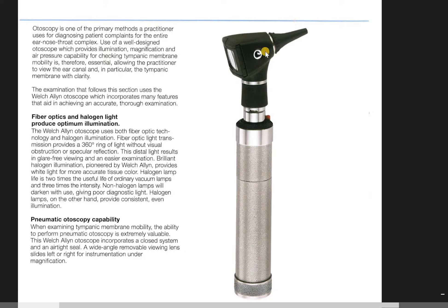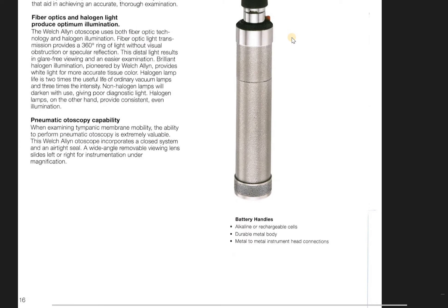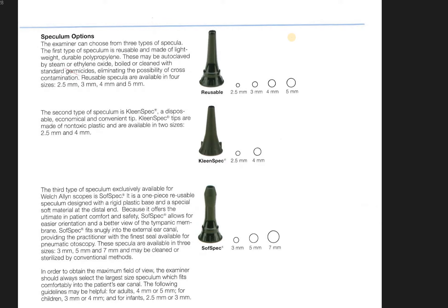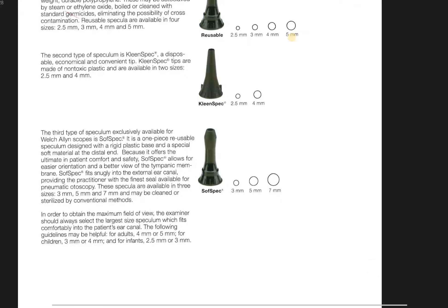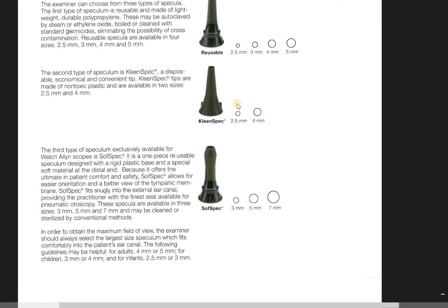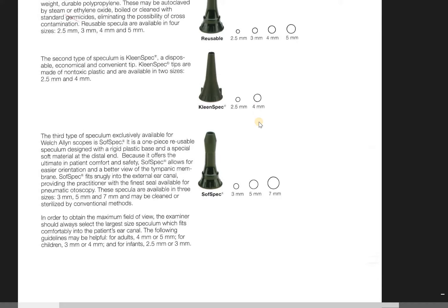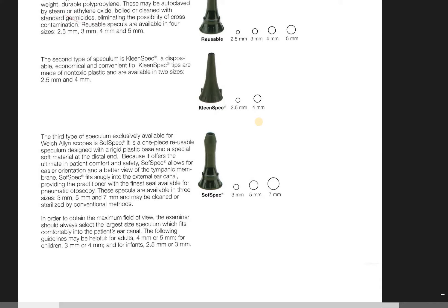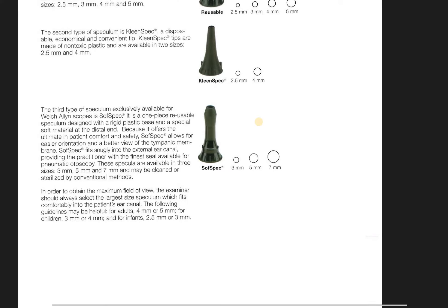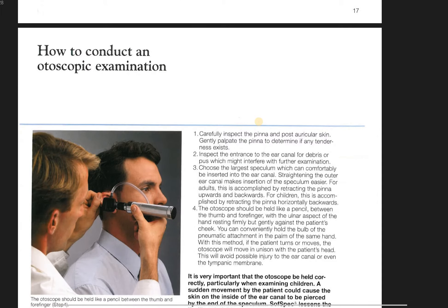You're going to have the otoscope and then the speculum. Mine are disposable — the 2.5 millimeter for kids and the 4 millimeter for teens and adults. It's a little bit of a judgment call; you might have an eight-year-old that looks fifteen, so you'll use a bigger speculum.